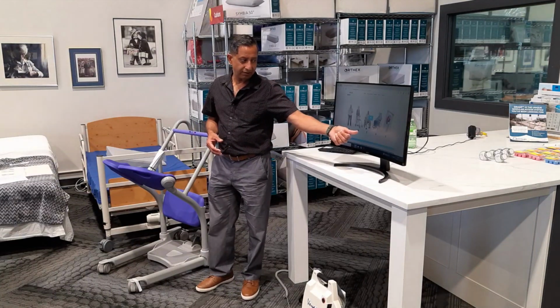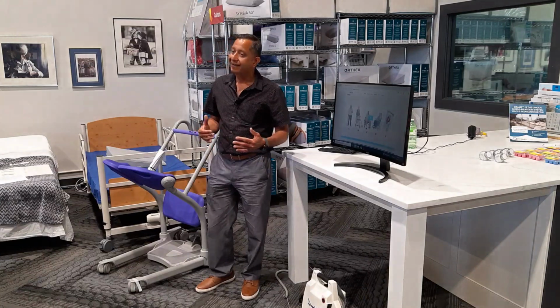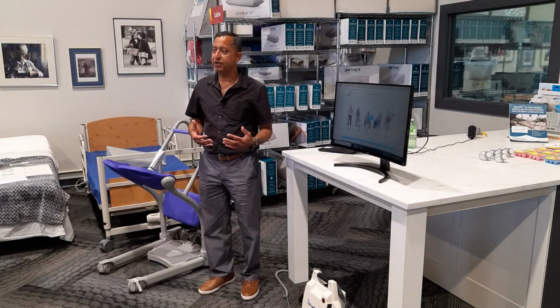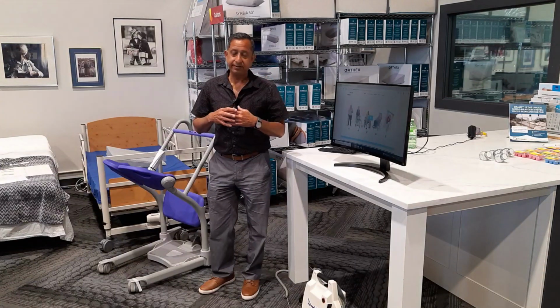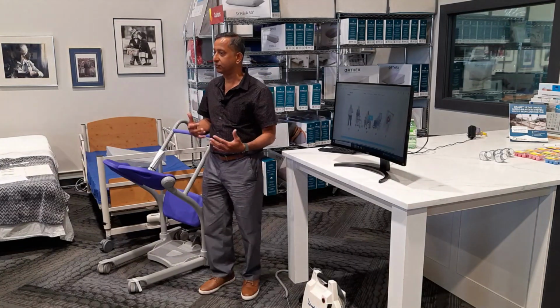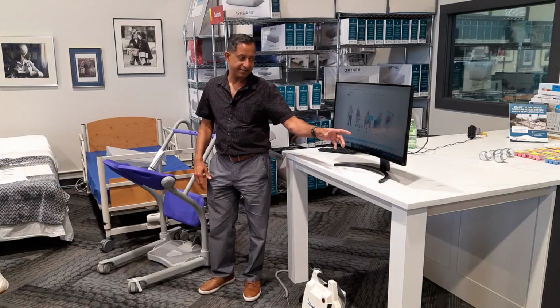Then comes Carl, who might be semi-paralyzed, is in a wheelchair, and can assist sometimes. He has 15-20% strength in the lower body as well as in the upper body. However, he can't stand on his own, so he needs some assistance in standing up and for mobility.